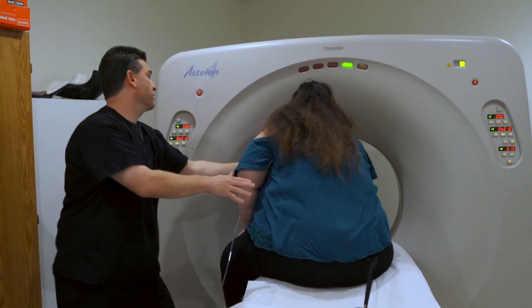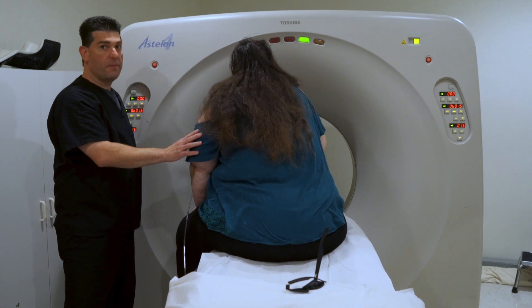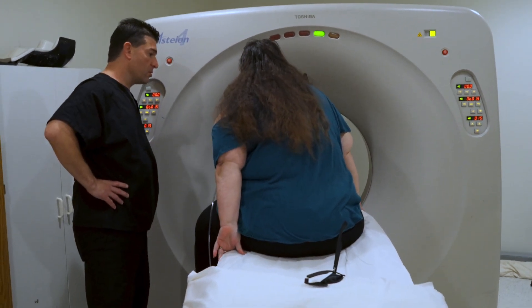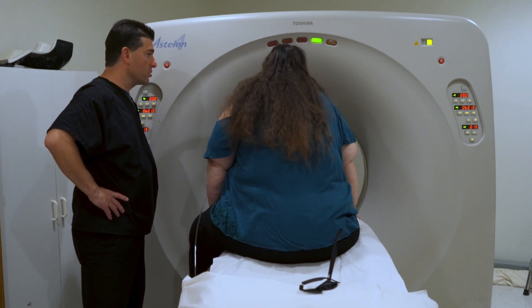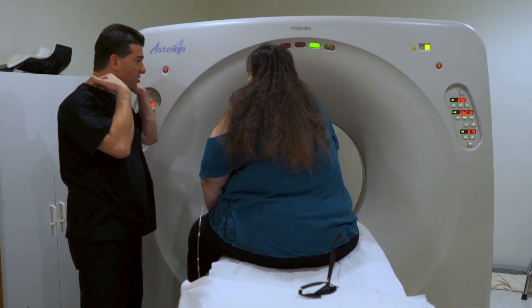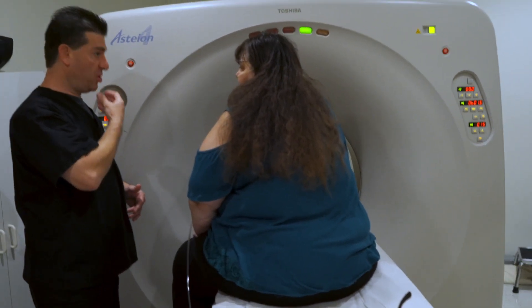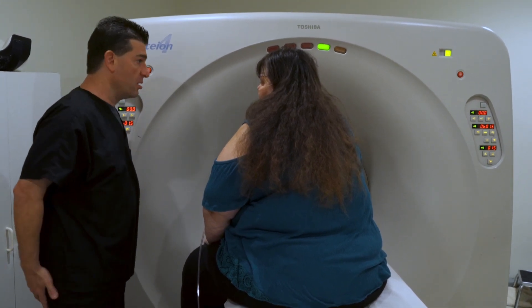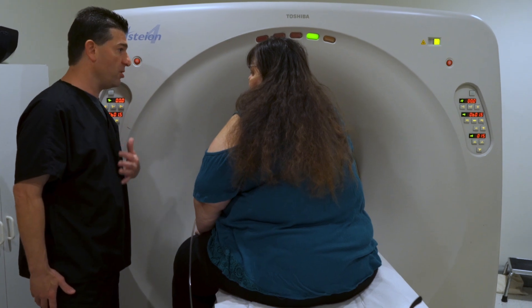You can't lay flat? Unfortunately, because we want to get the top of the chest, we're actually going to have you tilt your head back a little bit — we can't even have you use the pillow at all. Because if you put the pillow, your chin will be on the top of the axis of the chest, so we won't get a good exam. We'll try to lay down one more time, but I'll stand there. If you think you can't do it, I'll tell the doctor that you just cannot do it with the trach on your face.